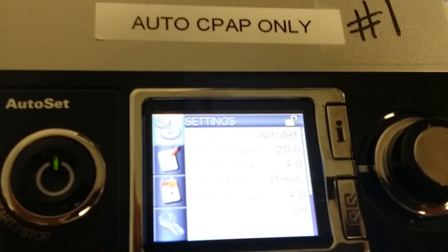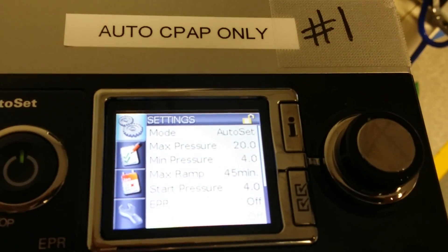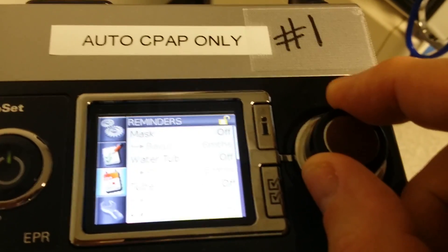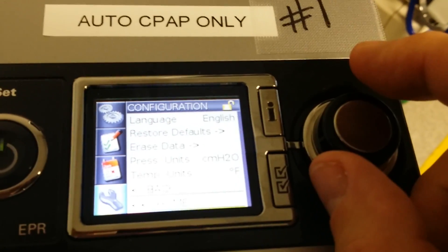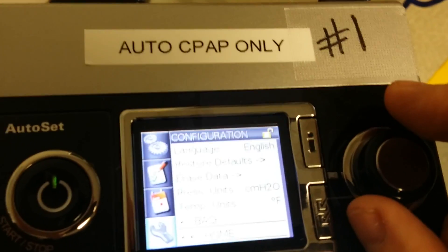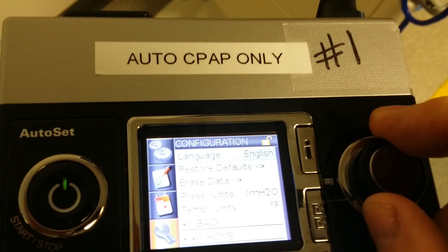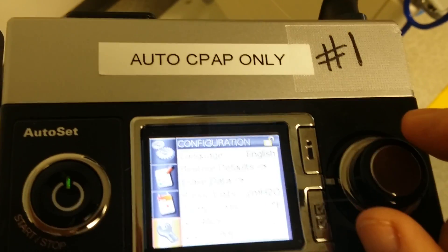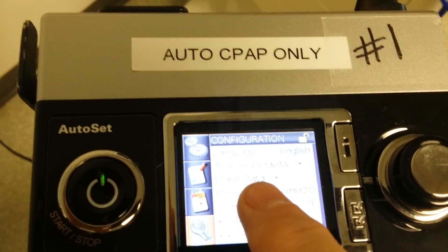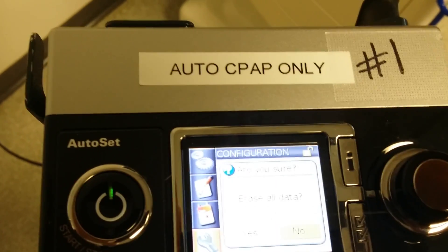You can let go and you'll see the menus. As you turn the dial, you'll scroll down to get to the configuration menu. Click it to accept that menu and scroll down until you see erase data. You'll see the erase data right up there. Click on that to highlight it.